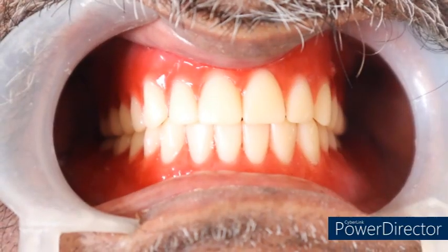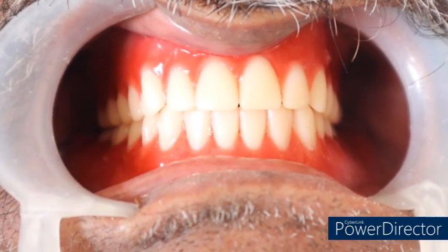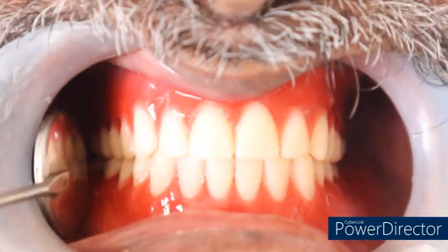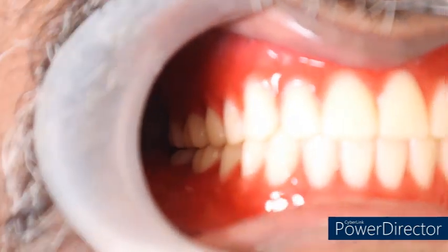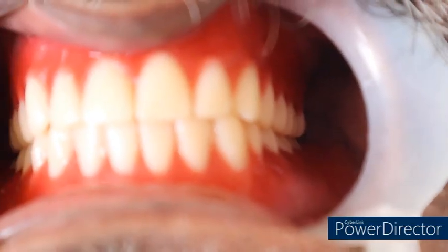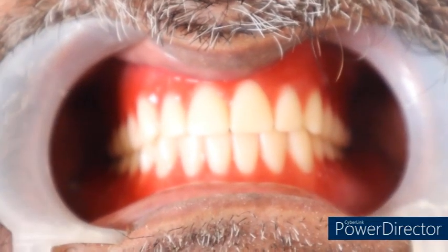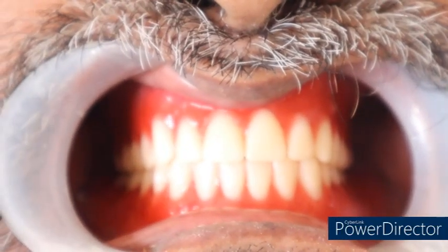To show clearly the centric relation, I have used the cheek retractor. Now you can see the simultaneous contact of the posterior teeth. When you see this side, it is all in simultaneous contact. It is clearly visible, and this side also it is clearly visible. So this is how it should be in the centric relation when the patient is biting. Any discrepancy here is a mistake in the centric relation, and you have to repeat the teeth setting.